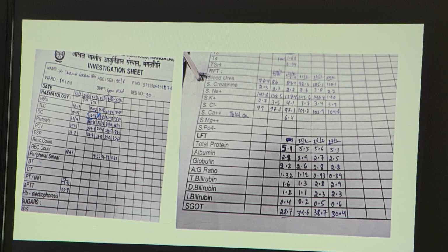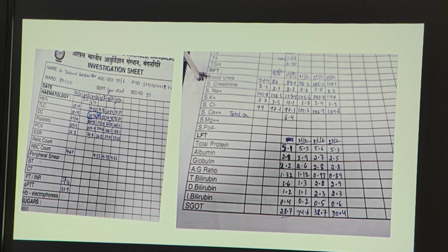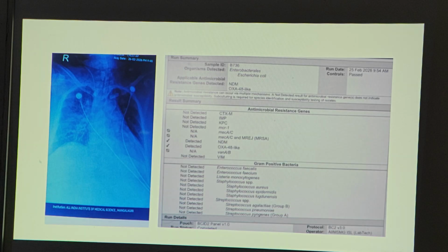So they sent blood cultures, and procalcitonin was a little bit elevated, and the SOFA score was elevated from the baseline. They sent both samples, from the central and peripheral line. In our lab, on the second day the central line flagged first, then the peripheral line also flagged. Both Gram stains showed GNB. So this patient has an elevated SOFA score and other sepsis features with underlying heart failure. It is a perfect case for this discussion. We put this for BioFire FilmArray.